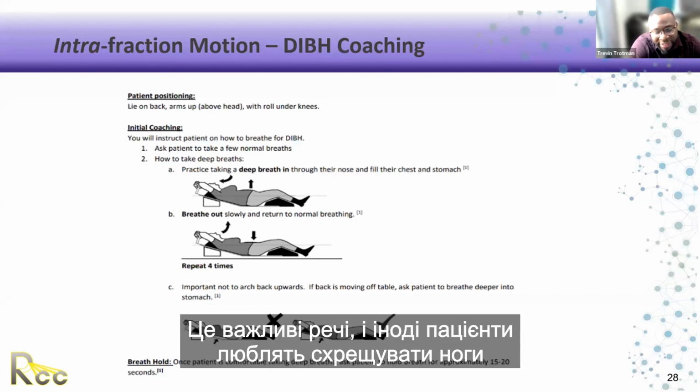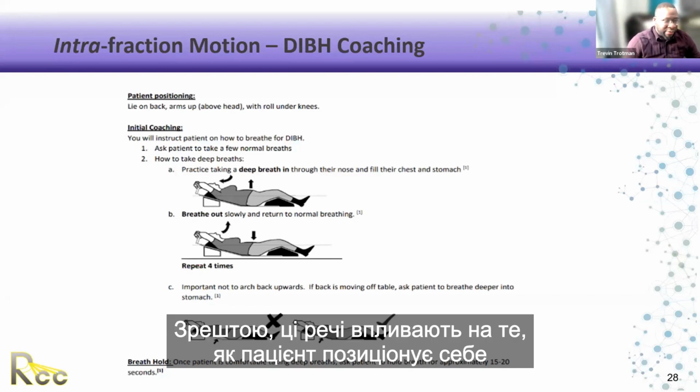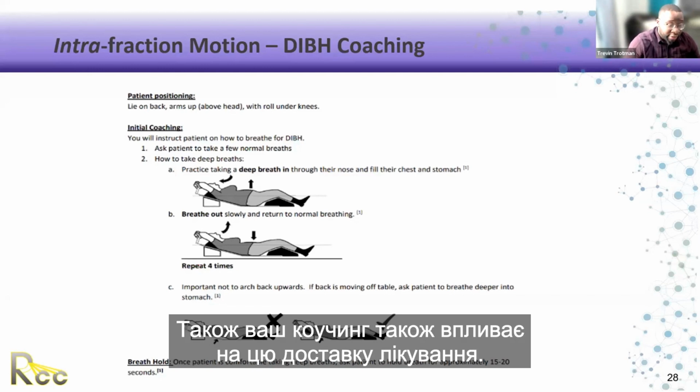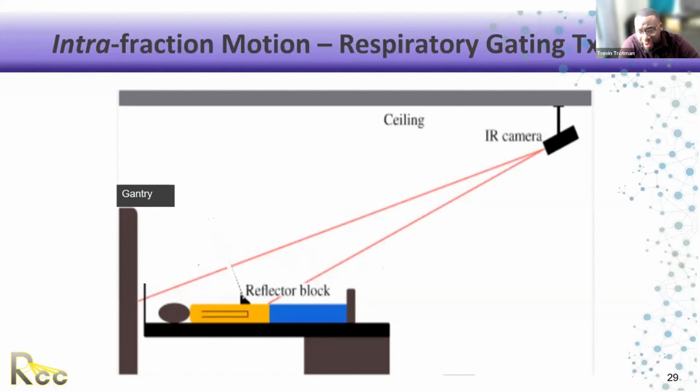So those are important things. And sometimes patients like to cross their legs too, or tell them not to cross their legs. So these things, at the end of the day, the main takeaway is that patient positioning impacts it. Also, your coaching impacts this kind of delivery too. So that's something we stress in simulation.